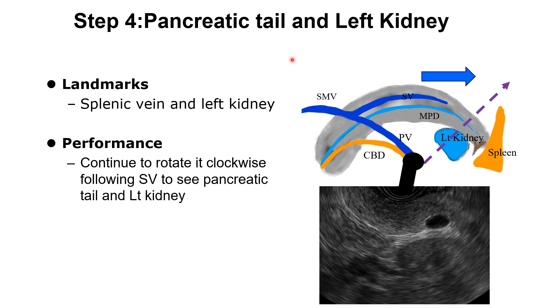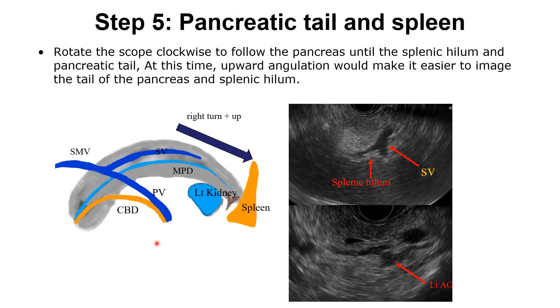Step 4: Pancreatic tail and left kidney. Continuing clockwise rotation and following the splenic vein, we can see the pancreatic tail and left kidney. Step 5: Pancreatic tail and spleen. Rotating the scope further, observe the pancreas until the splenic hilum. Upward angulation makes it easier to image the pancreatic tail and the splenic hilum. We can see the splenic hilum and the splenic vein dividing. We can also see the left adrenal gland by rotating the scope.